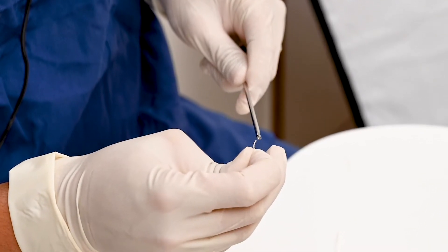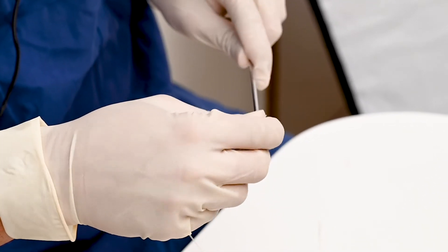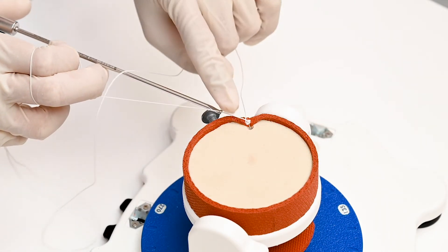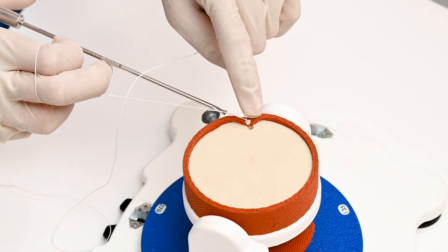This is the knot pusher. The tip of the suture is passed through the hole of the knot pusher. The knot pusher is passed over the post and slid inside so that the soft tissue will be reattached over the anchor point.